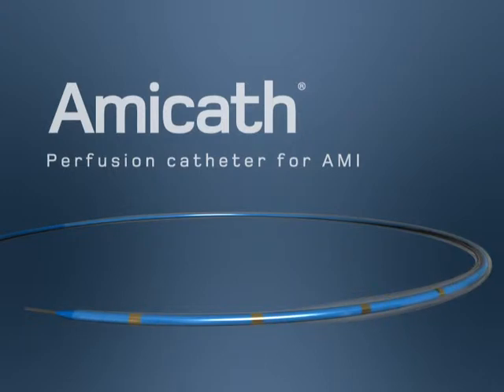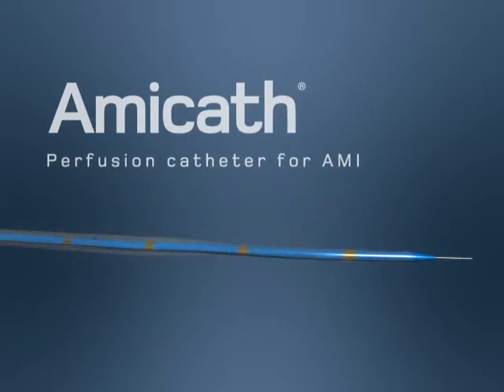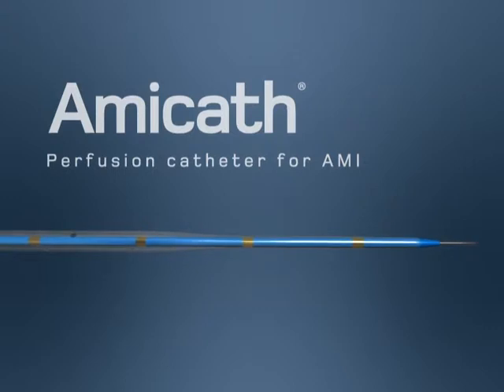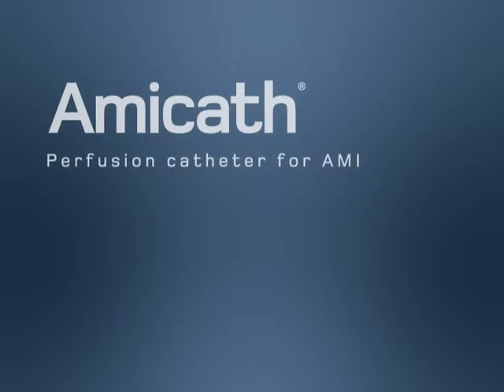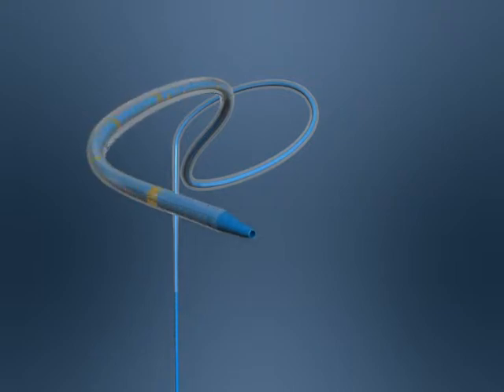The Amicath is a simple, quick-to-use and highly useful device for rechanneling the artery, delivering drugs locally, and determining the need for thrombus aspiration. The aspiration is carried out by means of the Hunter device without requiring any replacement of the guide. The conical shape of the Amicath, which widens from 0.017 inches to 1.5 millimeters, makes it possible to rechannel the artery by means of the Dotter effect and reduce the risk of distal embolism.